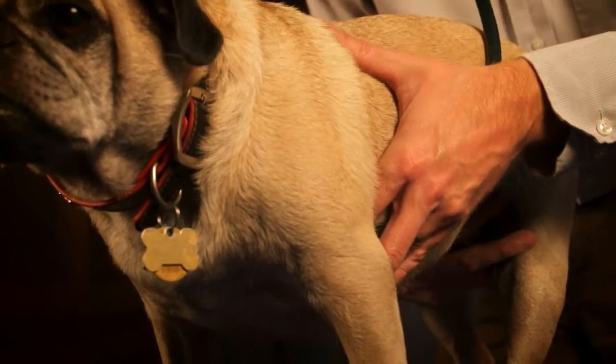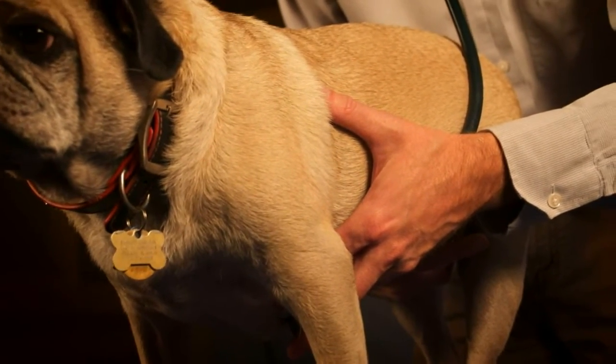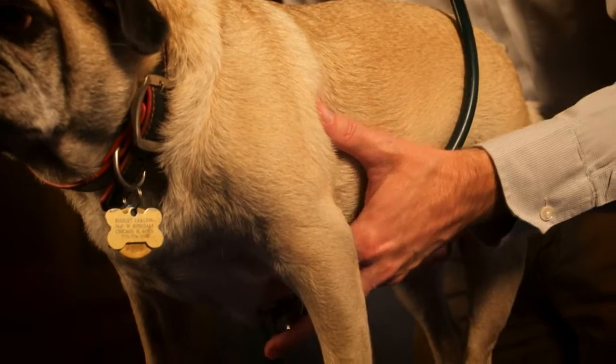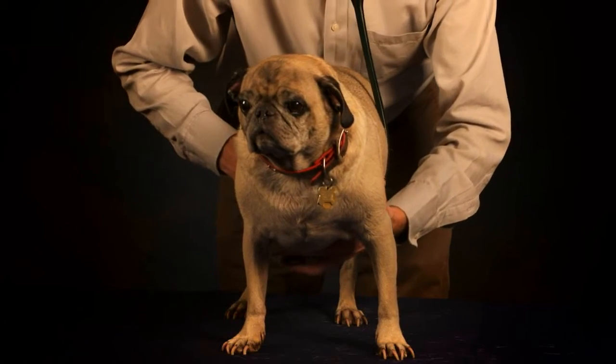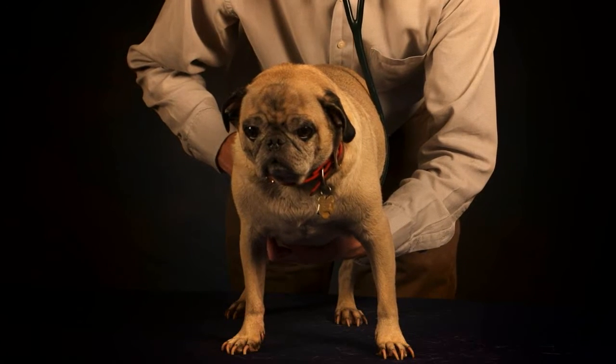Generally from the left basilar region, we'll sweep along the sternum. It's an important region to listen for cat murmurs, both the left on the sternum and to the right, and then we'll move to the right side of the chest to complete our auscultation.